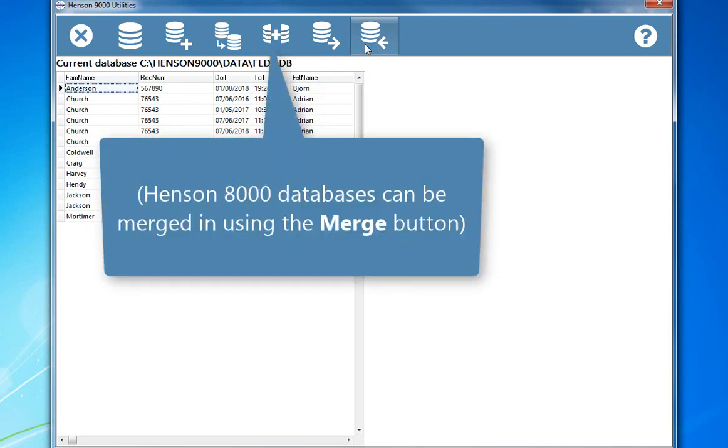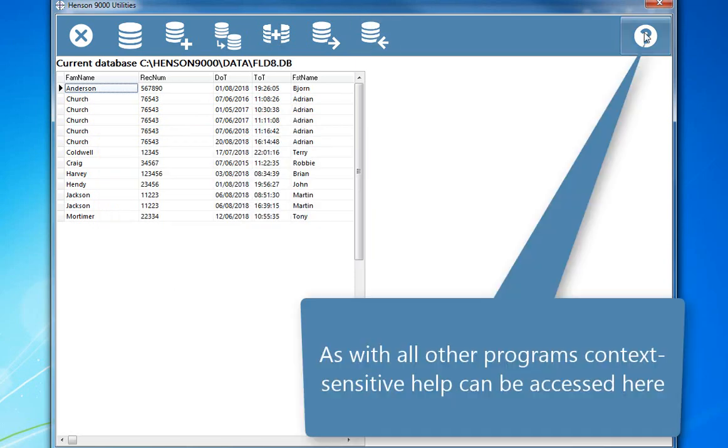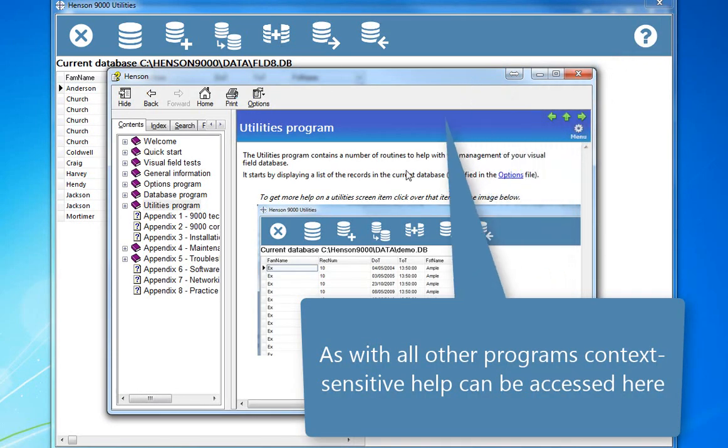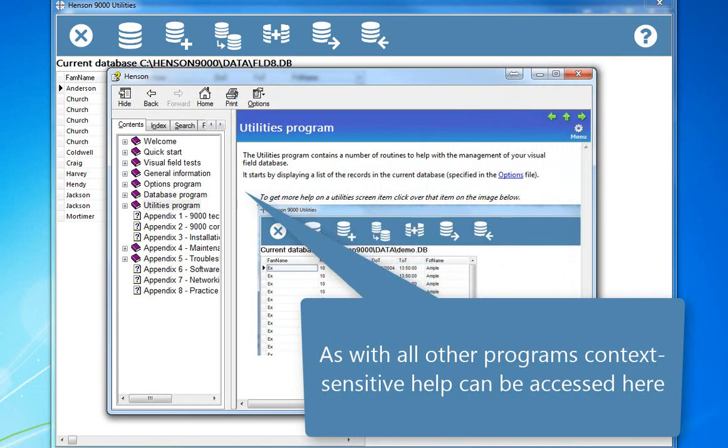Henson 8000 databases can be merged in using the merge button. As with all other programs, context-sensitive help can be accessed here.